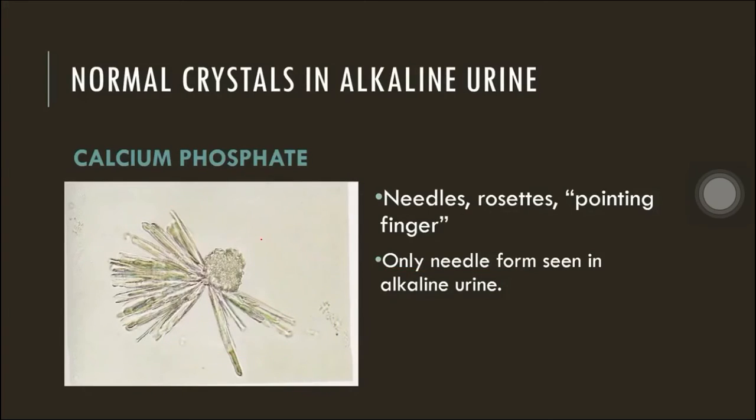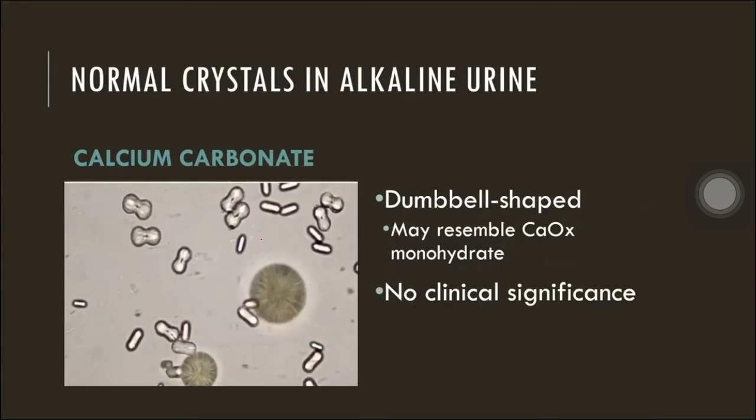Next, we now move on to calcium carbonate. Again, dumbbell-shaped, it may resemble calcium oxalate monohydrate. Tingin sa pH, for you to differentiate yung calcium carbonate at calcium oxalate monohydrate. Okay, so no clinical significance.